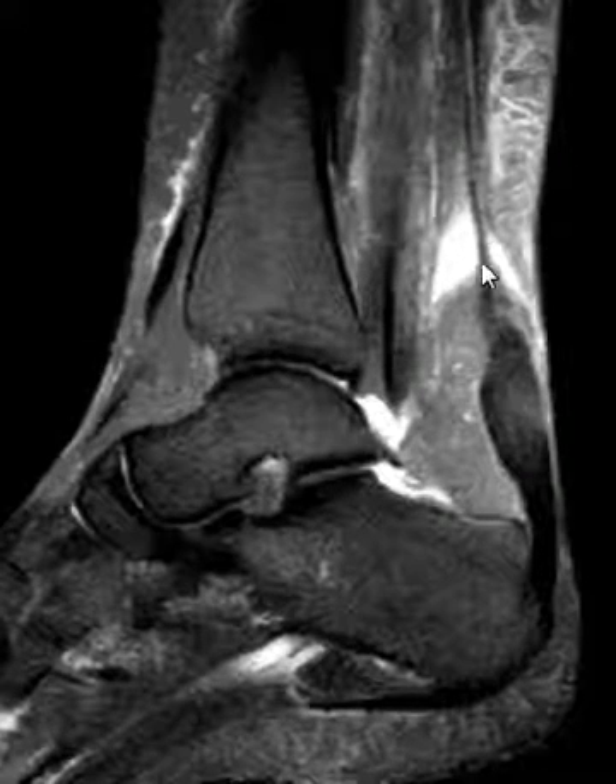I'm going to put up an axial view where we can see this. Here we have an axial image. We can see the Achilles tendon here, and right here it's completely torn. There's fluid at the site of tear.